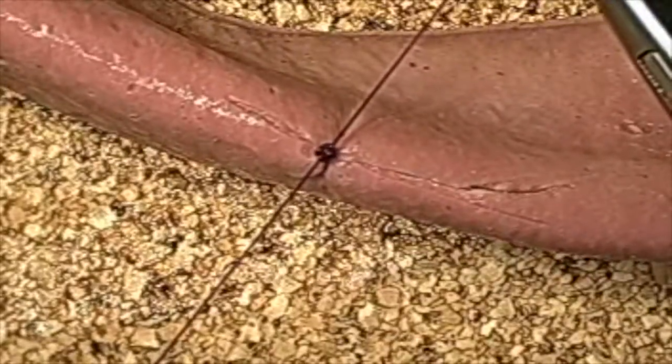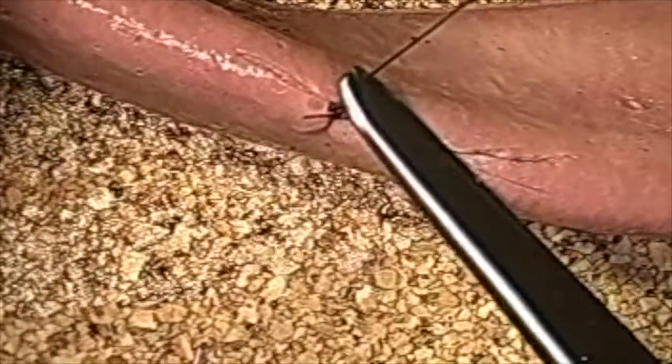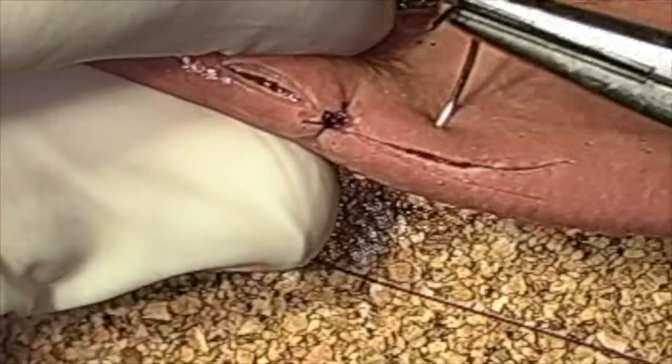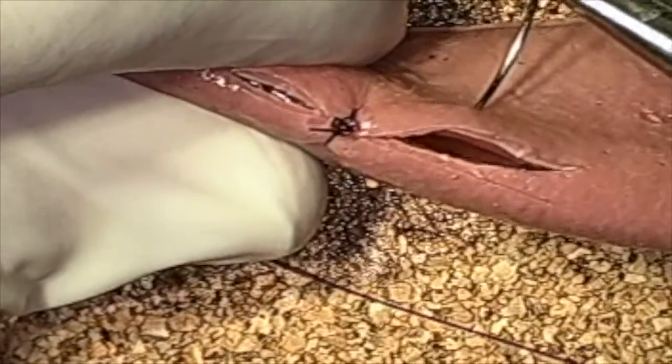And that's really what you want to do. Once you're finished, you're going to go ahead and cut your tag short with about two to three millimeters worth of suture. And then your subsequent bites are going to be also halved. This is not a mandatory thing. A lot of people start on one end or the other. But I like to half my segments. And you can see here, I'm doing a similar bite.